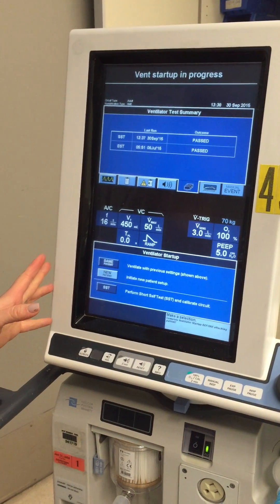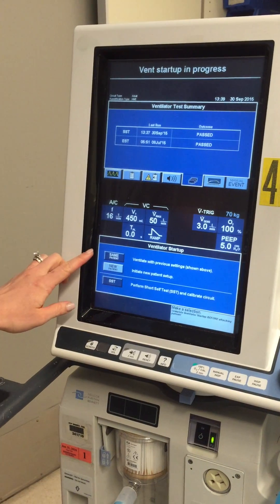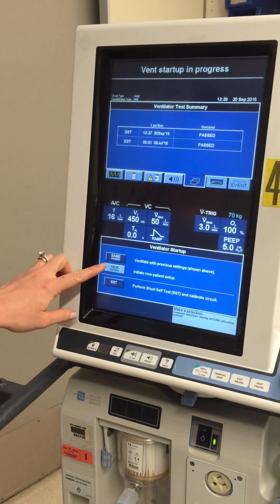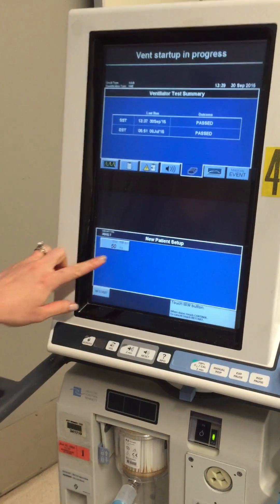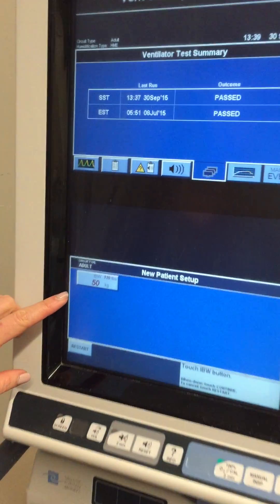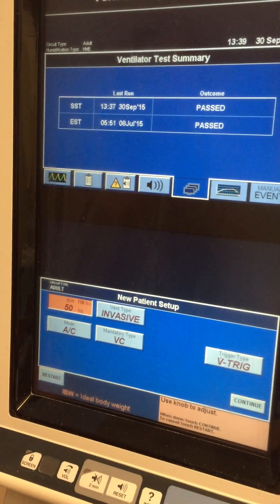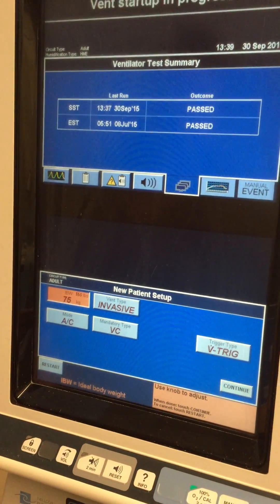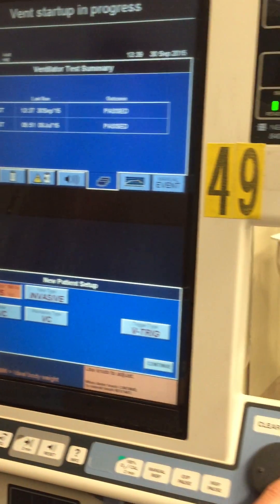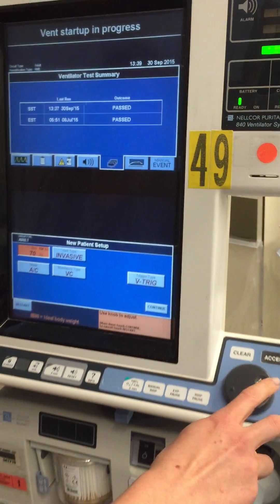When you first turn it on, you're going to press that this is a new patient. As for a weight, you can put the weight in if you want to.